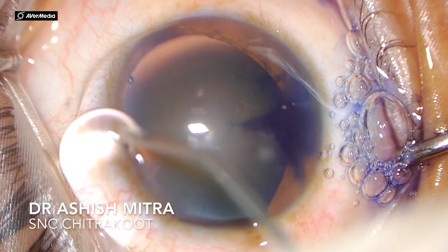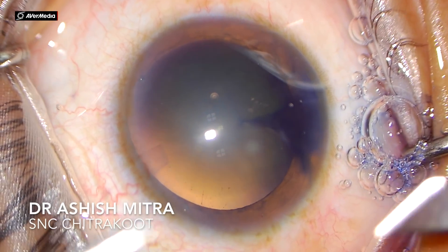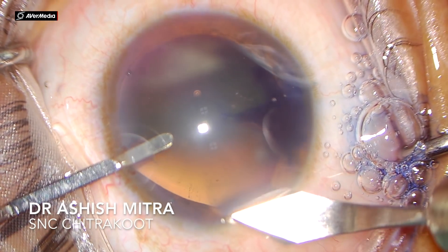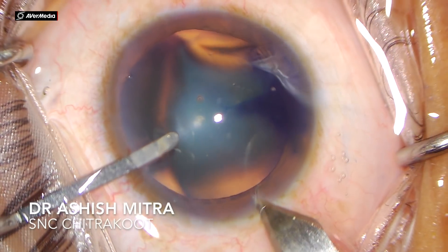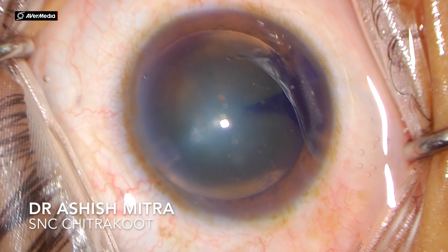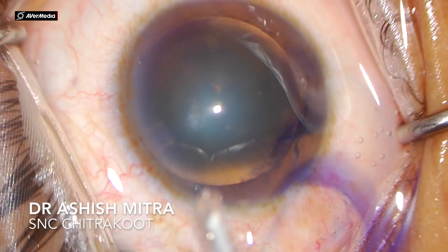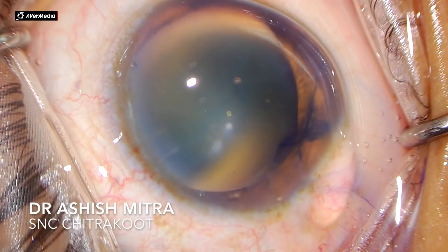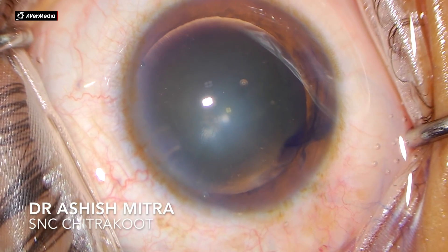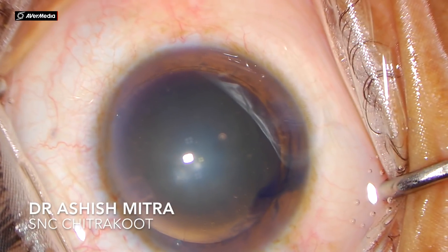What I recommend for beginners initially is that you should be very selective in your case selection. Try and select grade 2 cataract for your initial surgeries, because grade 2 cataracts are not very hard and you can actually emulsify those cataracts and hold them whenever you require to hold them to chop.